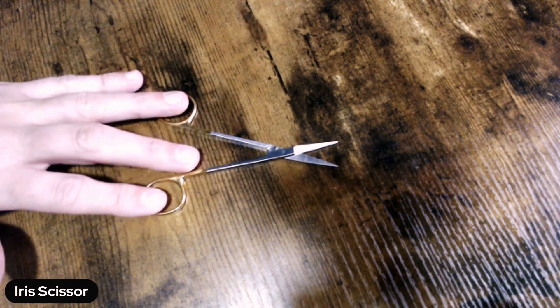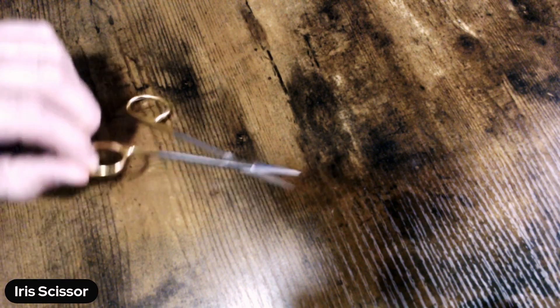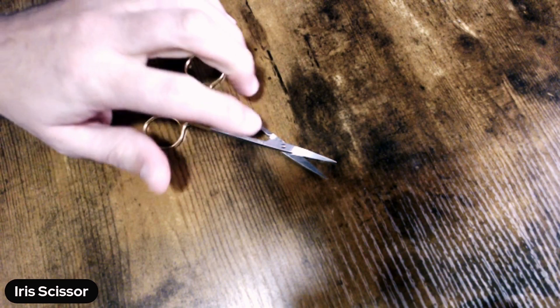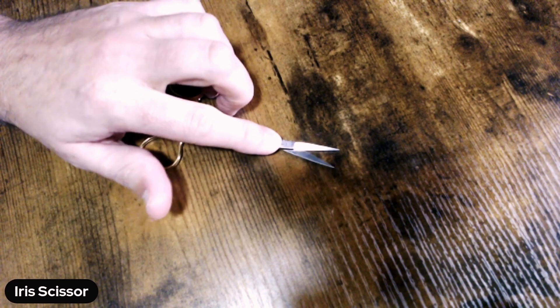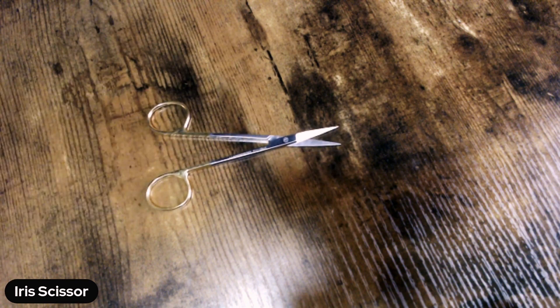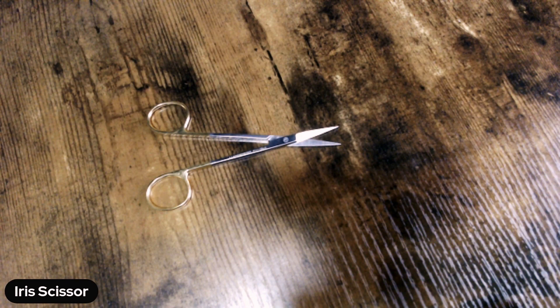One last note that we'll make on this iris scissor in particular is if you flip it over, you can see that little Phillips head screw. Looks like a little screw in the middle there. Do not try this at home is the phrase that you should walk away when you see that screw, because it can be tempting to try to make a repair if you happen to see a scissor that has a loose screw or if that cutting action is a little too smooth.